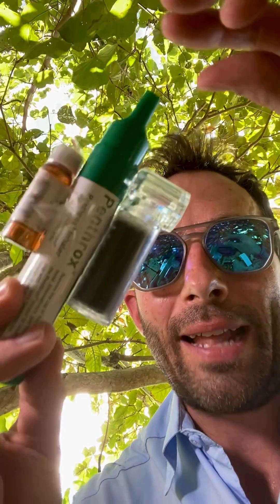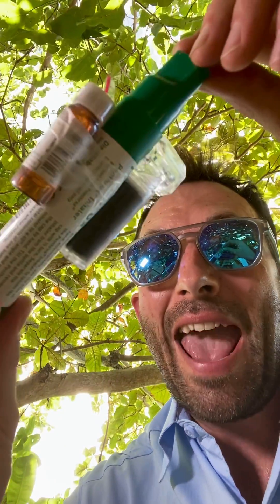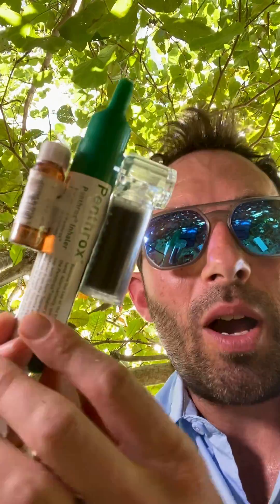This is Penthrox, a lightweight and portable device for patient-controlled analgesia in any pre-hospital care or wilderness setting for the management of acute pain including trauma. I'm going to show you quickly how this works.